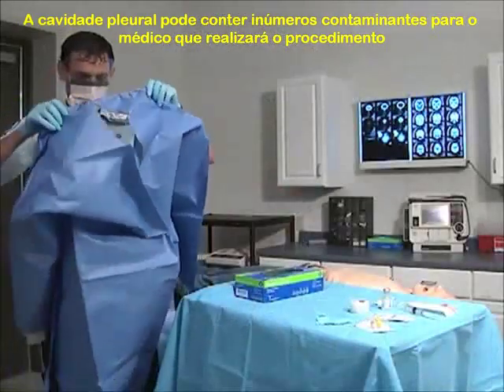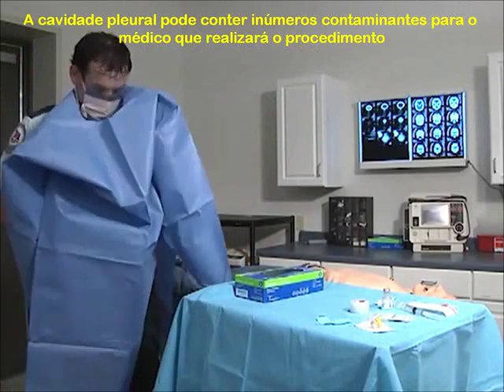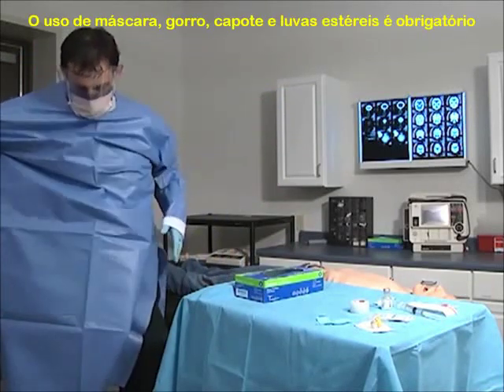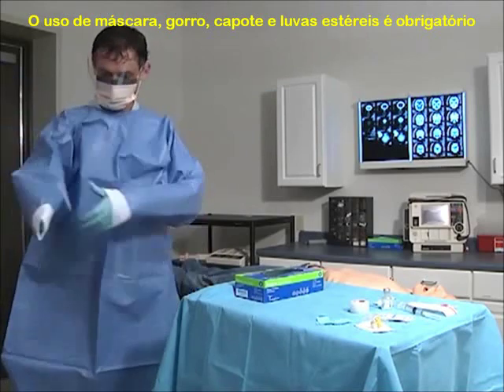The air in the chest cavity may propel potential infectious material toward the medic. The use of gloves, gowns, and eye and face protection are recommended.